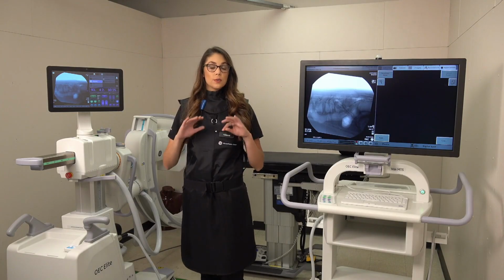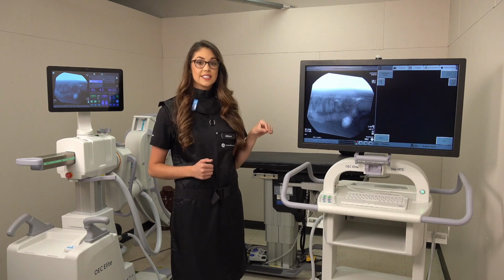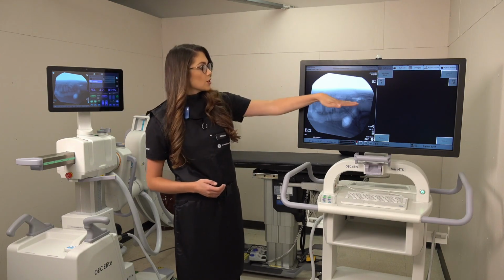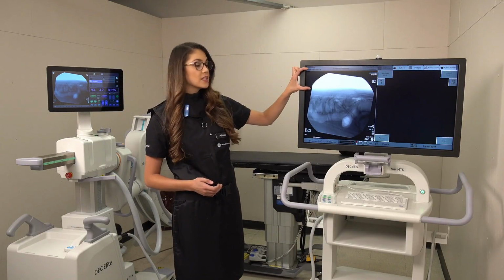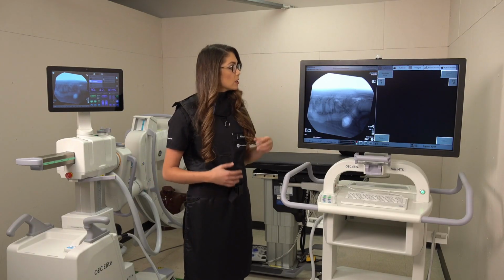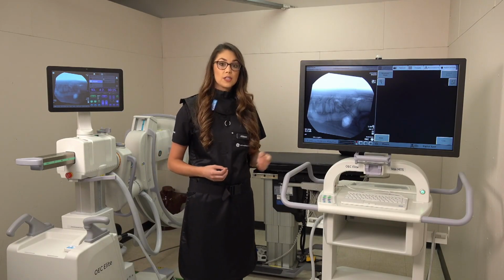First step before you even use the collimation tools is we want to make sure that our image is centered. This is a lateral lumbar spine. We are centered within our field of view, and you'll see this dead space, or blank air. By using two collimation tools, we can remove this and have better image quality.